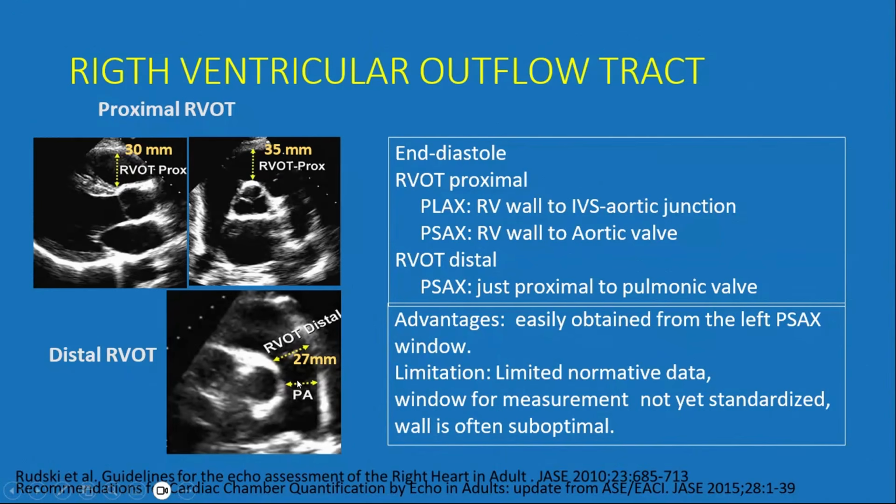And the PA, in our routine practice, we measure the PA, and we visually see whether the PA is bigger than the aortic diameter. If not, then the PA size is normal. So the ratio of PA to aorta is less than 1. But if it is 25 and above, then it is called dilated.